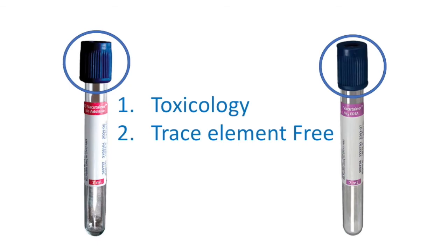But they have to go in the order of draw somewhere, so how do we know where to put them? It doesn't make sense if we say yellow, light blue, red, green, lavender, gray, because these are dark blue, royal blue. But look at the stickers here. We have one that has a red sticker and the other one that has a lavender sticker. You guys with me so far?